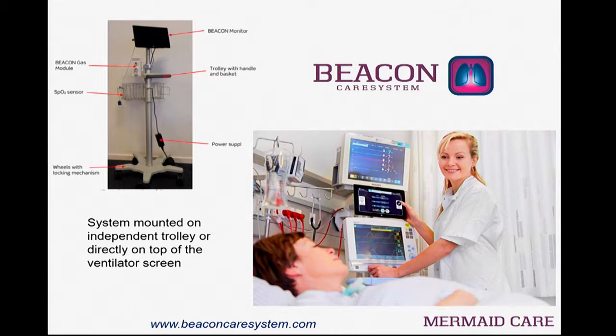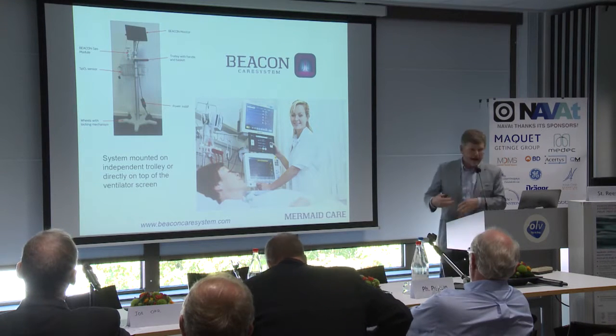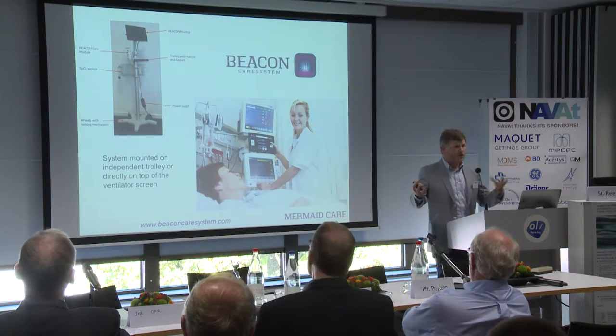And that sits behind the ventilator screen, and it provides advice. So what happens in the machine is, as it's collecting the calorimetry and flow data and pressure data, it's fitting these models, and then it's searching the decision space for what is the best settings for the ventilator for this patient, given this patient's physiology.